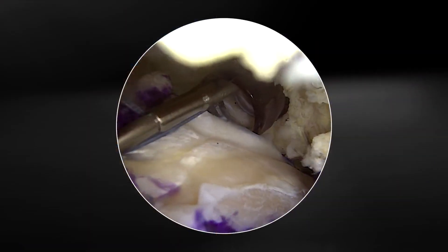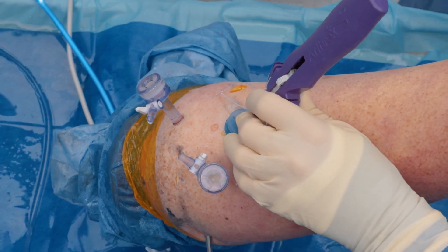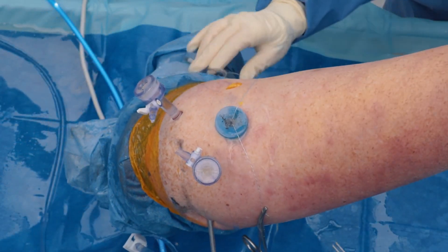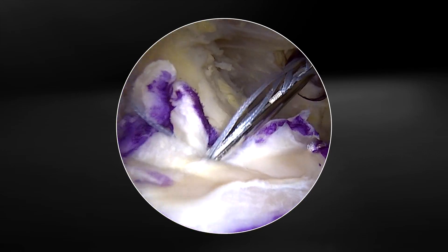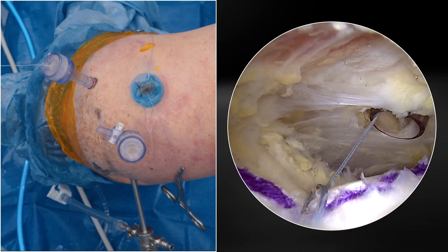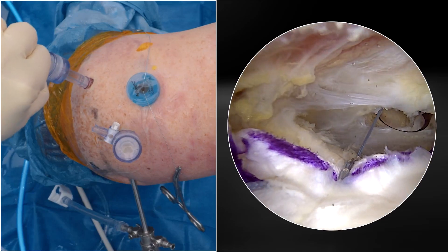Once that's done, we're going to cut the excess edge. Additional stitching is quite easy. One could remove the tissue passer, which is what I generally do now. We can bring the spreader completely out and now we have our patch in place. Two stitches we found is plenty to do this, but if you want to really spread out the graft or if you want additional fixation, this technique of throwing in some extra stitches has been an excellent way to spread out the graft over the top.